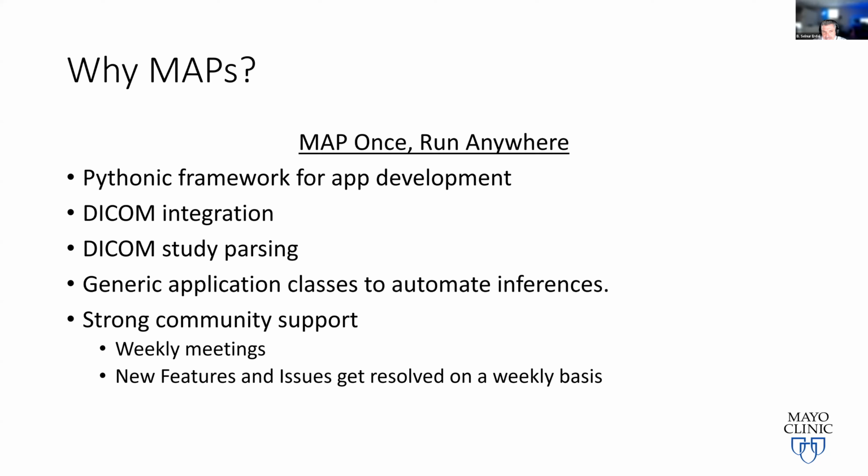So the idea is, you map once, turn that application into standards, run anywhere. You can take this into your cloud, or you can run on-prem, you can run on your desktop, wherever you want. But why would you run on your desktop? Once you build your application, that's the first step you do, you test it. But from test to deployment, everything should be reproducible and deployable, okay?